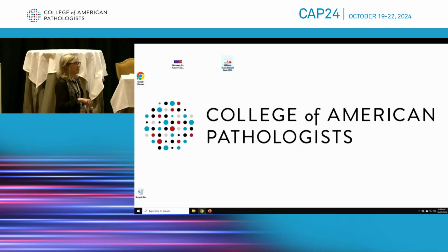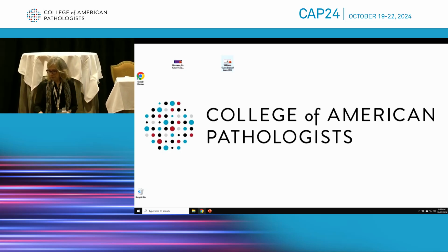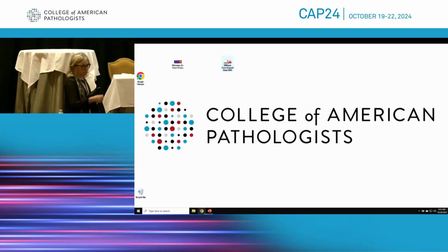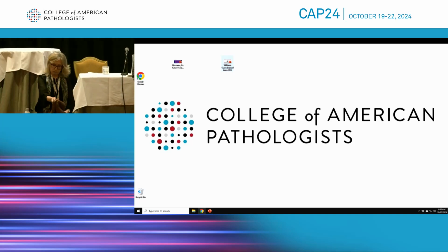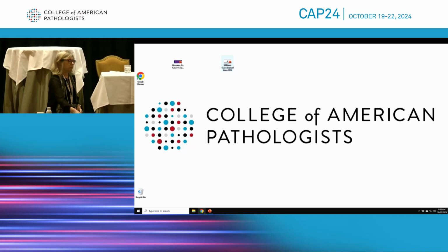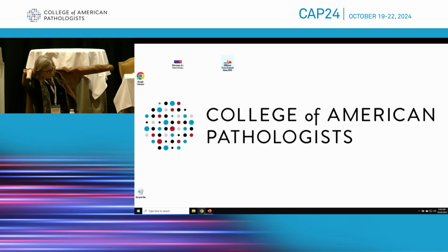Dr. Williamson, sir, I have a question for the renal case you shared. Actually, Dr. Jericho and I have a few of these kinds of cases that are really tough because morphologically, just looking at density, tubular structure, and clear cell features, the actual profile is not conclusive. So in this situation, how often do you do molecular testing for the final classification?